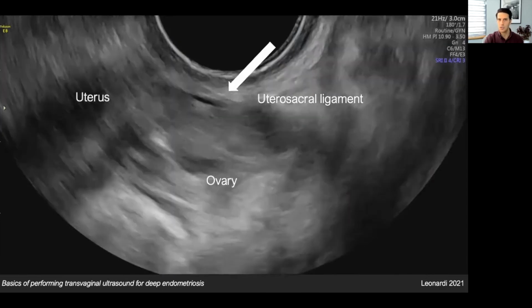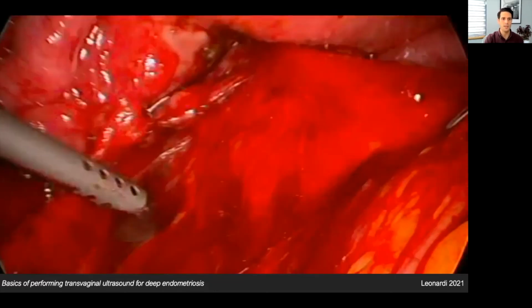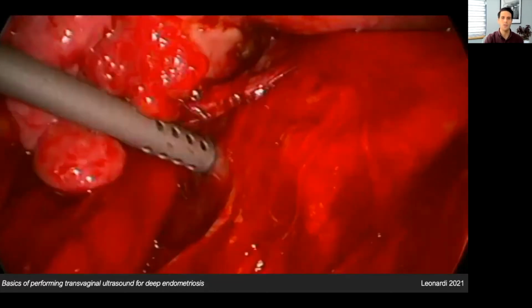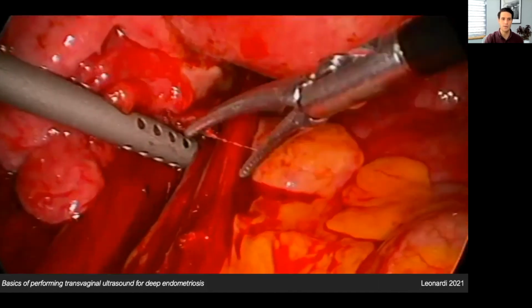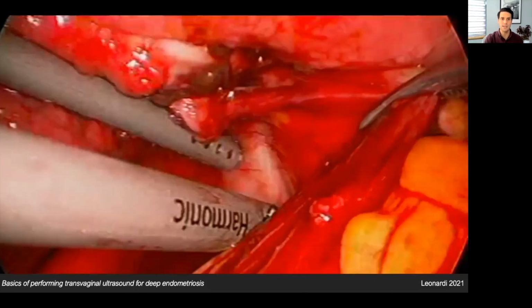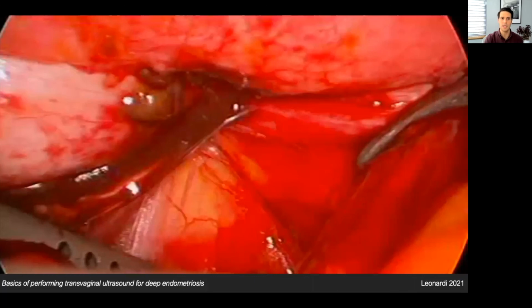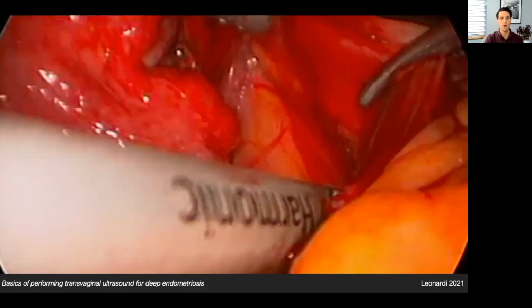I haven't shown much in the way of surgery depictions, but in this case, I am showing this exact scenario. So we have our uterus, ovary, and our ureter in view here. As we proceed through the video, we can see that that ovary is completely stuck to the uterosacral ligament, which is about to be grasped. The ureter is being pulled into the area of disease. And as we start to mobilize the ureter laterally, we can see that the spill of that small endometrioma is occurring.